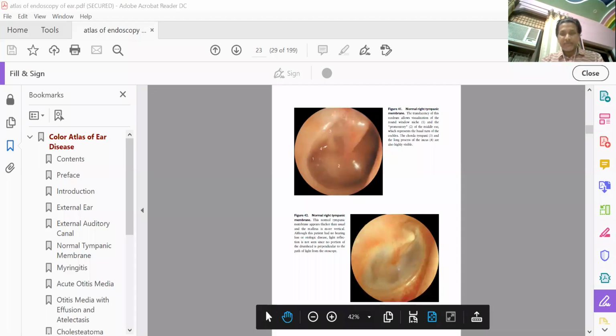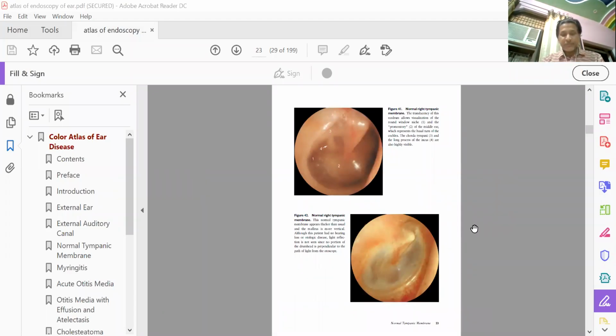Hello, friends. In the sequence of ENT lectures, I am continuing with a very important topic, which is also very validated in clinical practice. So let us again continue with this topic of endoscopic appreciation of tympanic membrane and middle ear disorders. This atlas is freely available for teaching and training purposes, and the copyright claim is also mentioned in this video.